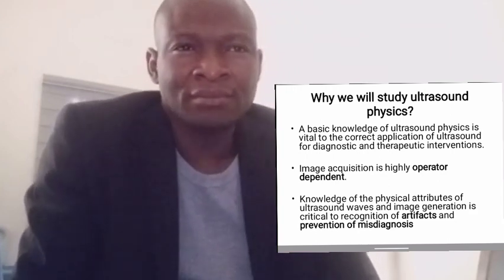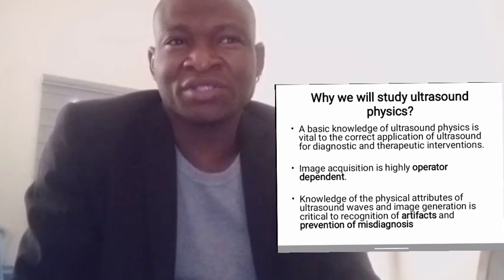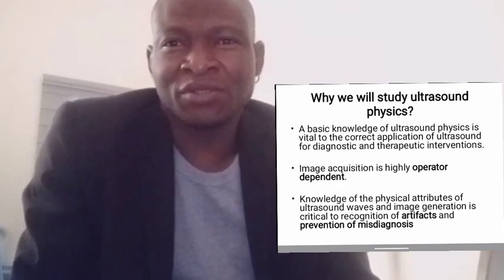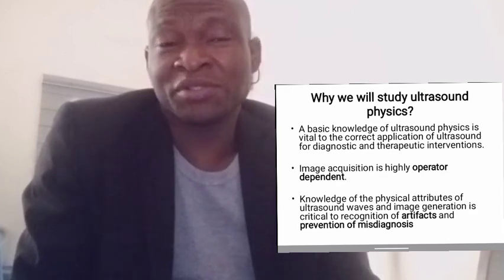There are certain rules you have to obey, maneuvering skills you need to have to be able to produce certain images. Knowledge of physical attributes of ultrasound waves and image generation is critical to recognition of artifacts and prevention of misdiagnosis. So artifacts will be produced because of the behavior of sound, and that may pose some challenges, but there's a way around it, using artifacts to help with diagnosis. That will be discussed in other platforms and opportunities, but in this case, we want to prevent misdiagnosis.